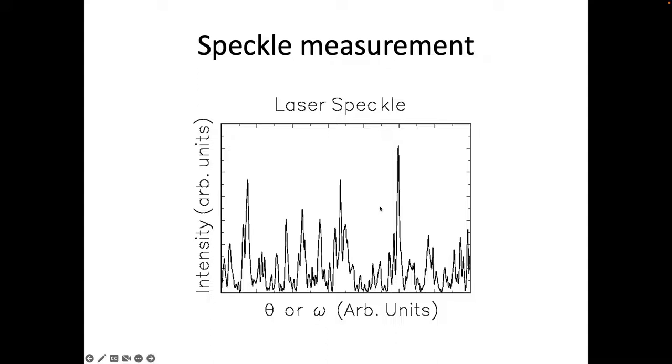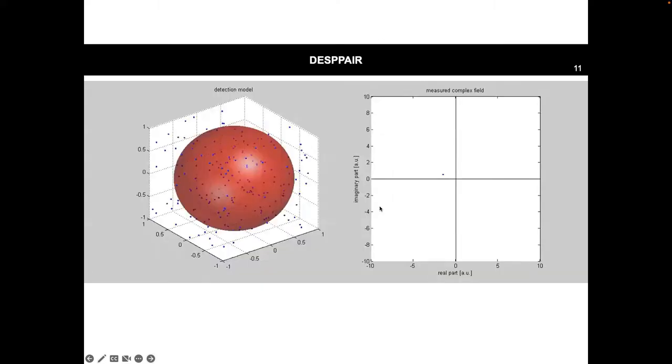Okay. So this brings me to another method of doing Doppler. And the idea is as follows. I have a collection of particles, point scatterers, that move through a volume. And in red is indicated what the volume is that I can measure with my OCT. So in the transverse direction, it's my focus. And in the longitudinal direction, it's the coherence.